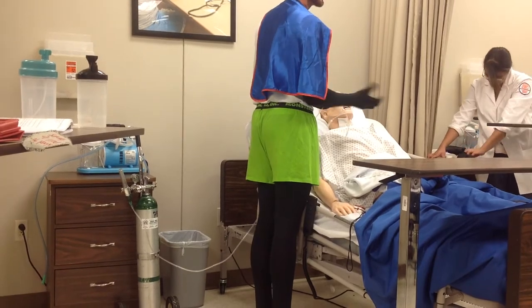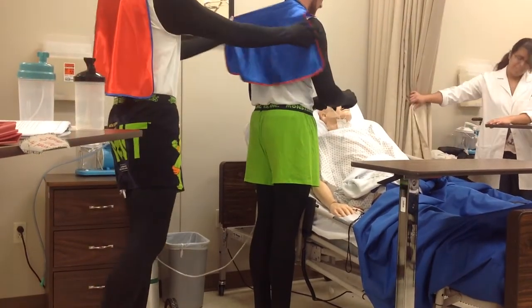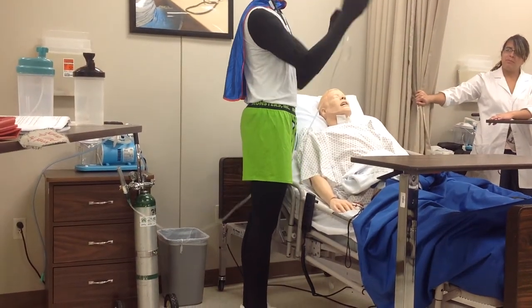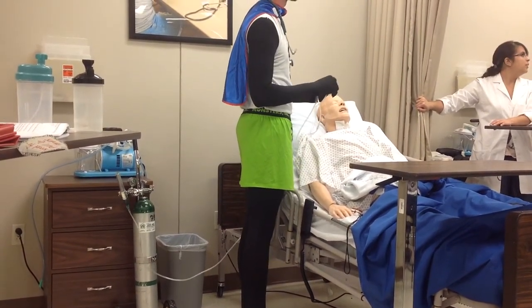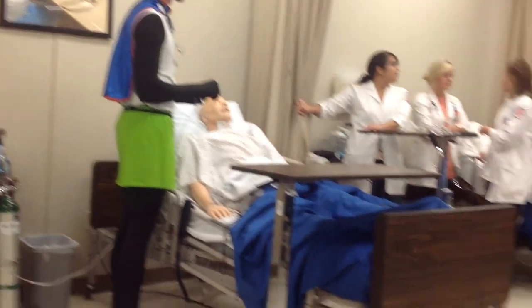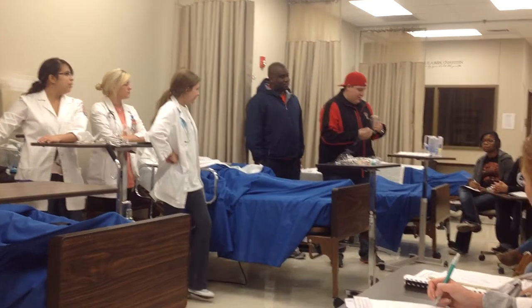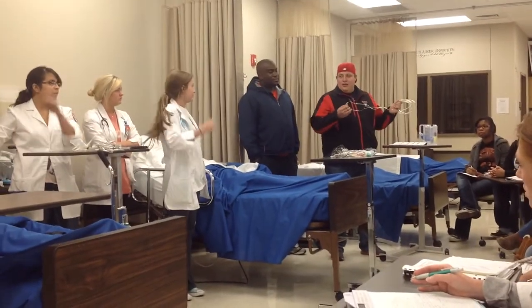So everything's clear. I don't see any break in skin integrity or anything like that. So, do you want to go ahead and tell him? That's your turn. We're going to talk about the different kinds of delivery systems that we have. I'm going to do the nasal cannula, which is what he's putting on right now.